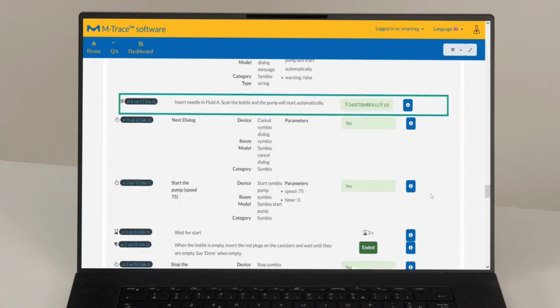Here, for example, we see the pump activity profile of a test. The detailed measured pressure profile is also recorded and shown here. This can be used to prove that no overpressure occurred and the Steritest canisters were not incubated under pressure, which potentially can harm microorganisms, and so can lead to a false negative result.